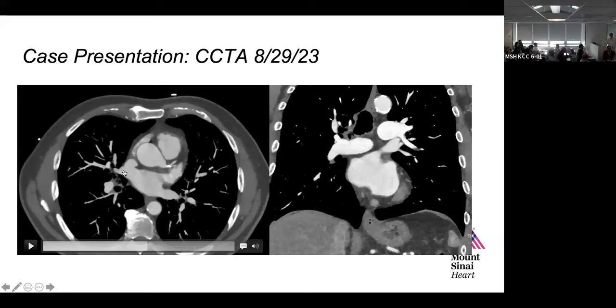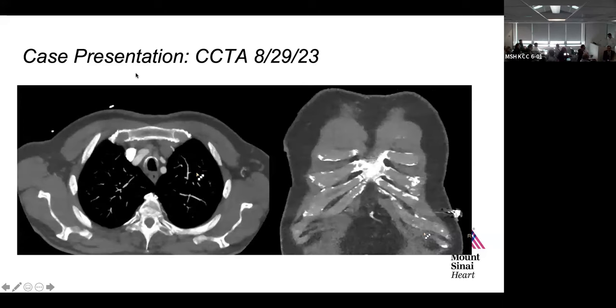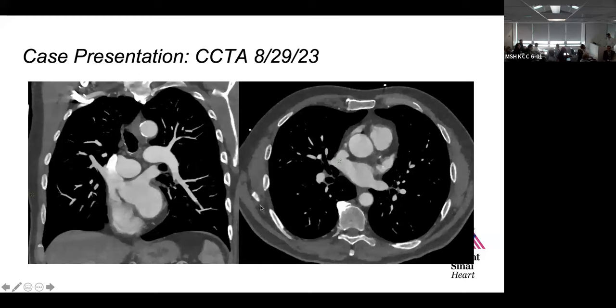And then if we were to look at a sagittal view, we would see the superior vena cava straddling that area, straddling the atrial septum. That's a very nice image right there. Right, you see it straddling. And then you showed very nicely where the right upper pulmonary vein drains with respect to the RPA.